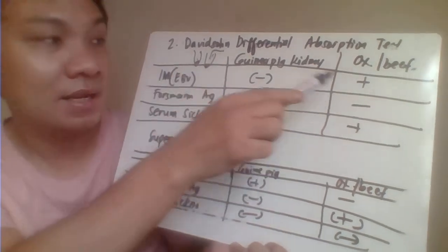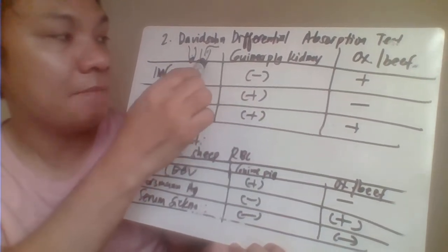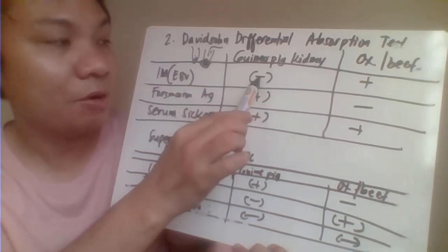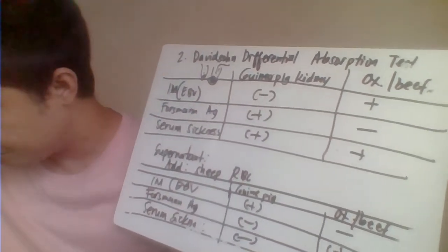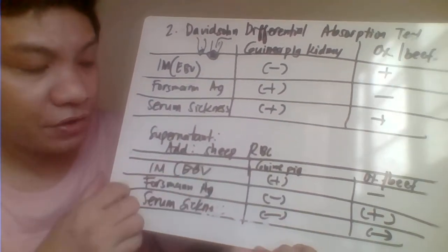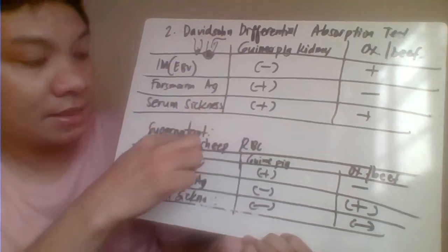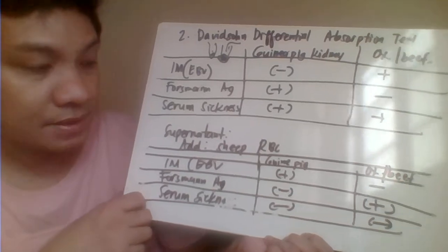It's because since na-adsorb siya, dito na makikita ang ating antibody. So, ang supernatant mo, wala na siya. Just in the case, for example, pag hindi siya na-adsorb, meaning to say, still andun pa rin siya sa supernatant natin. To check for that, then you need to perform another test with the use of your indicator cell. Take the supernatant, then try to check with your indicator cells in the form of sheep red blood cells.